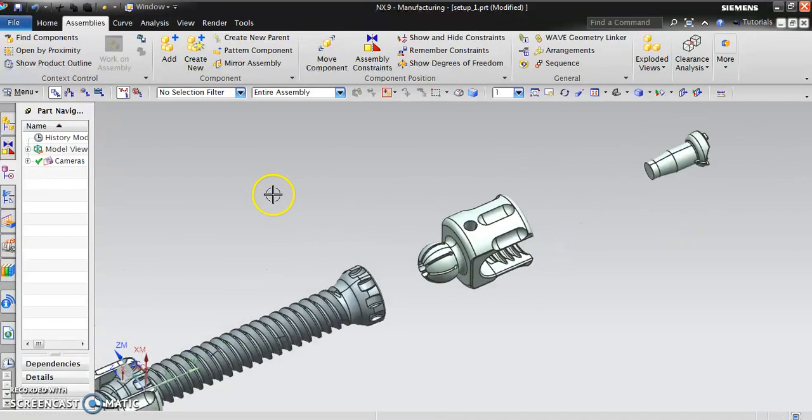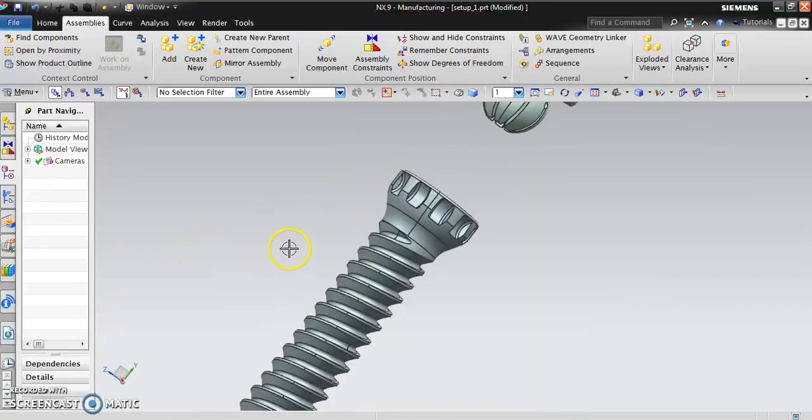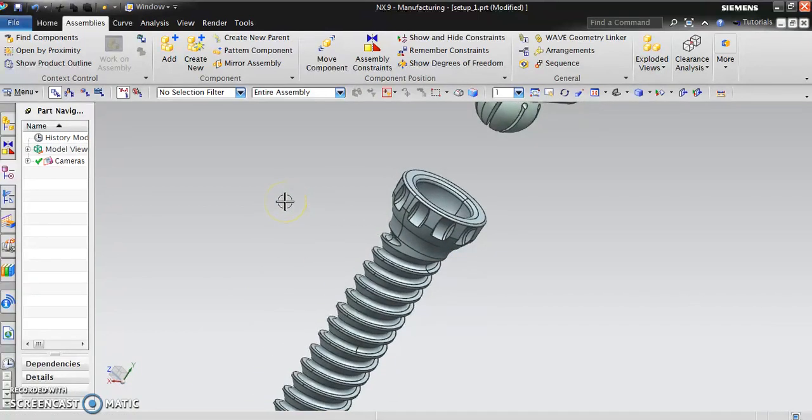So once the right material is bought to make these spinal components that meet the yield, tensile, and elongation specs, the next thing to talk about is how to apply the different tool paths to make these implants. One of the critical features of these implants on the pedicle screw, as you can see, is the thread system. I did cover the thread system in my old videos, but I can give you a gist of the concept of the system you're looking at.